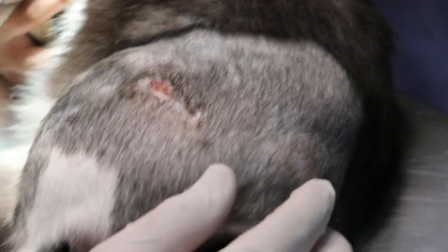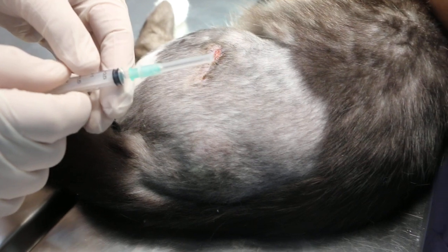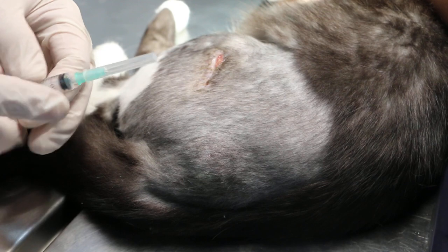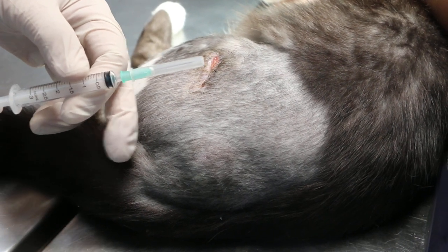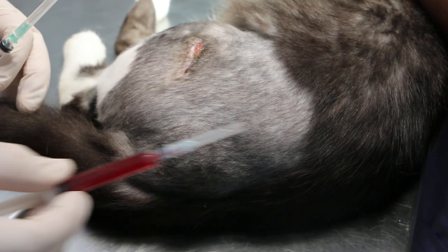Now, 17 days later, which is today, the owner complains that there is a swelling — there is a big swelling here. When I examined the cat by palpation there was no pain, or very little pain, so it's unlikely to be an infected area. But we have to use needle aspiration to find out. If there is pus it will come out yellow.